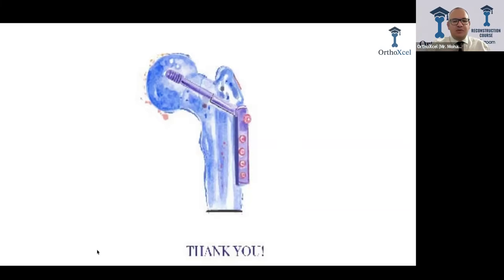vertical offset. So with modular prosthesis, you can change the length or the offset, but keep in mind that the other one is changing. That's why if you're putting in a hemiarthroplasty and your tissues are under a lot of tension, you're reducing the offset or you're subsiding or bedding your stem more in, you're changing the length and at the same time you're changing the offset. That's why when you get your stem more into the canal, this should mainly reduce the length, but actually it reduces the length and the offset. That's why you feel that the offset or the tension is less.